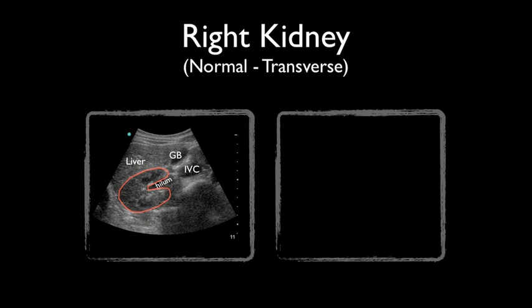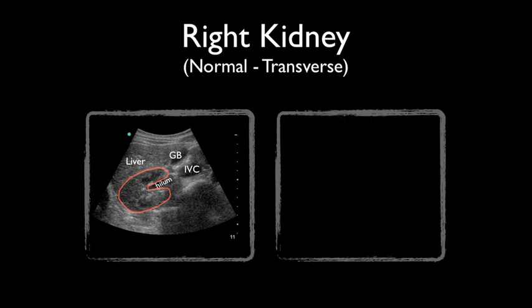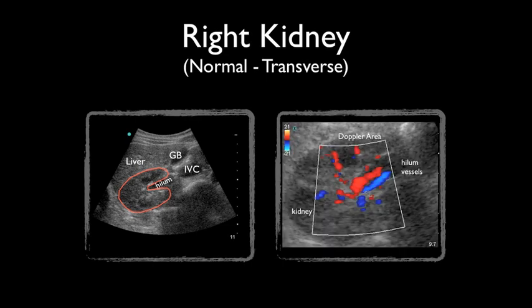Ureters are usually not well visualized with ultrasound, but when distended may appear as tubular structures extending inferiorly from the kidney. From the transverse position, you can see if the kidney has any blood flow. On the ultrasound console, find the color button and simply place the color Doppler box around the area of the hilum.